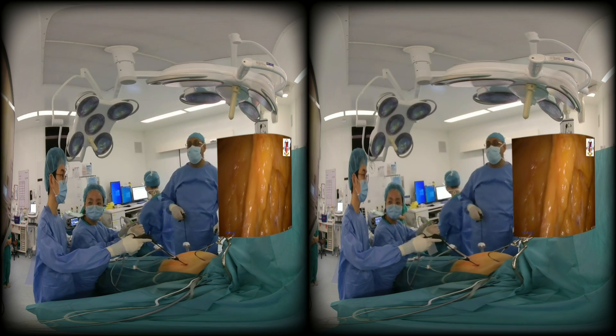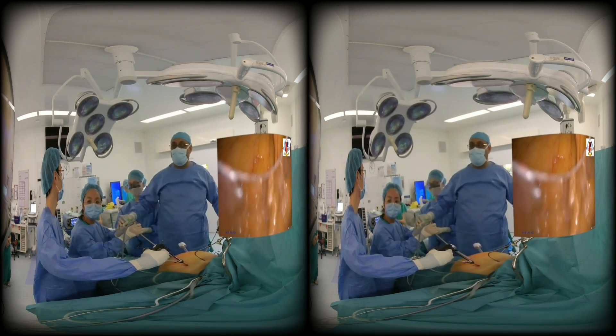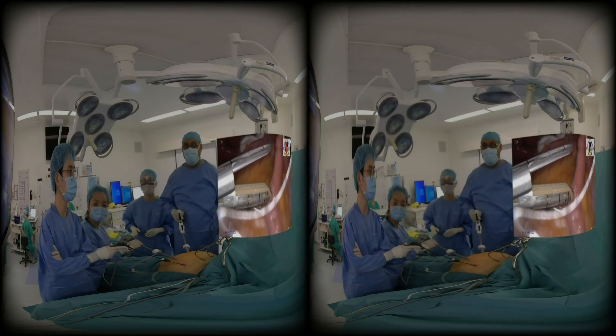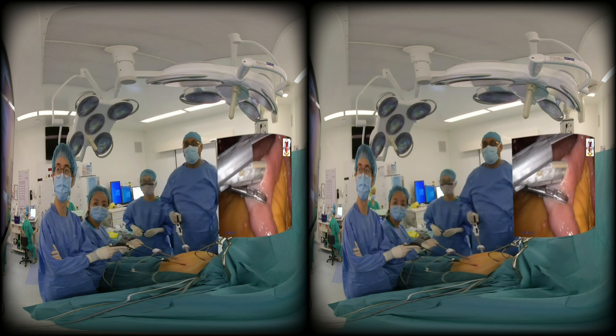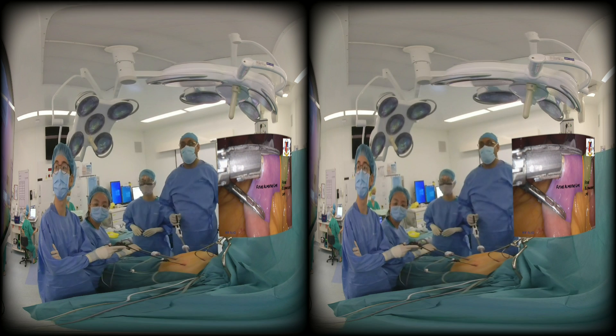In this particular patient, the omentum might be a little stuck. Once you flip it, you can see the colon, and it will prevent injury to the colon. After that, an enterotomy is made. Here you have to be very careful that your biliopancreatic limb and your alimentary limb never flip. That's why the cameraman should not move and you should never take your eyes off this limb.